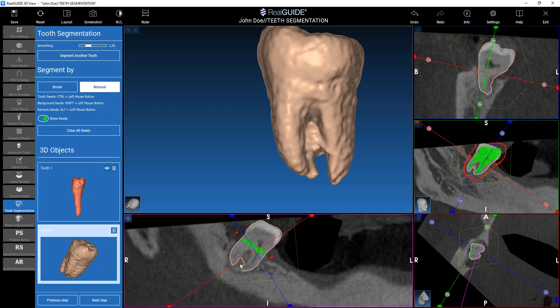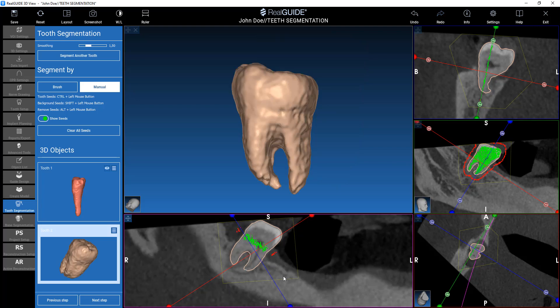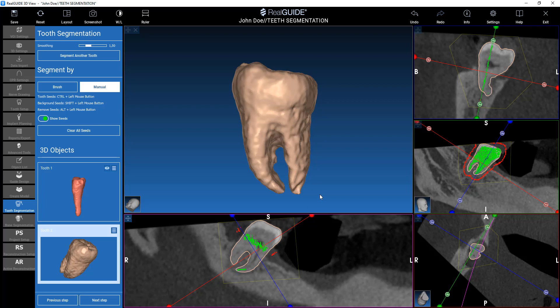We need to tell the software that, for example, this part is not part of the tooth. In order to do that, we add background seeds here — click Shift and with the left mouse button draw a line in between. Releasing the mouse will automatically correct it. And here, where we have a tooth, we are adding tooth seeds by clicking Control, and the software checks that.